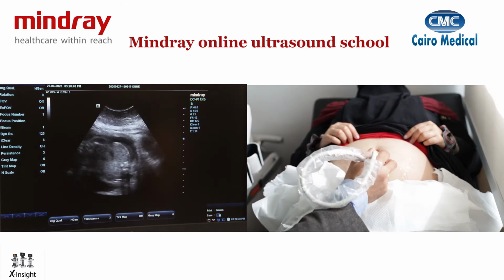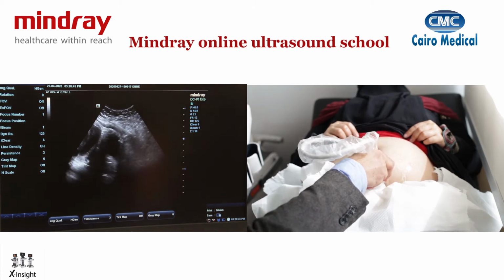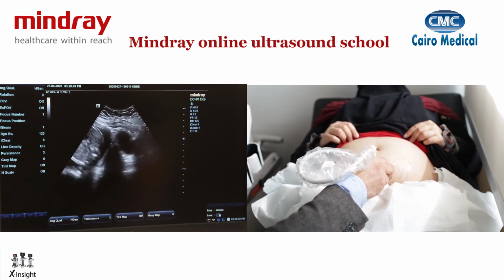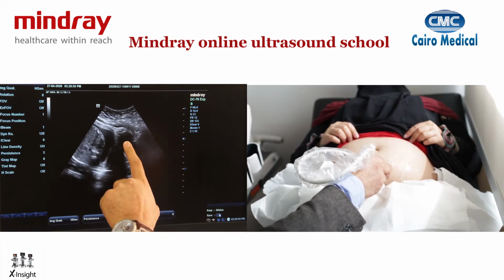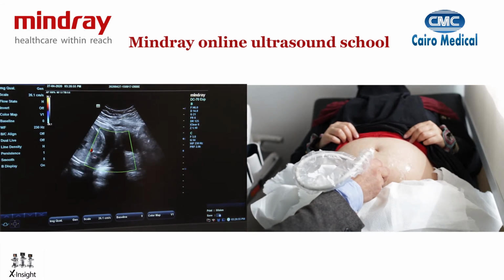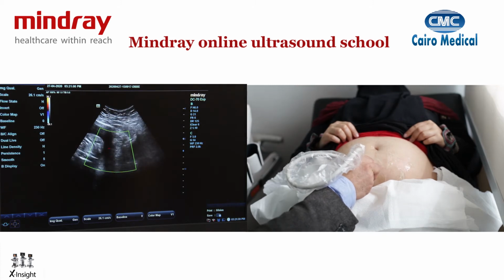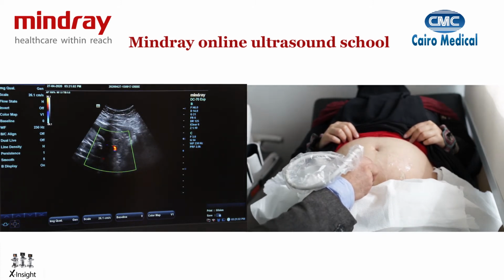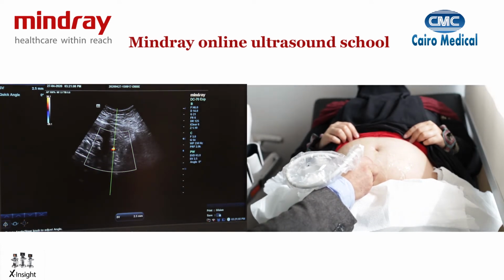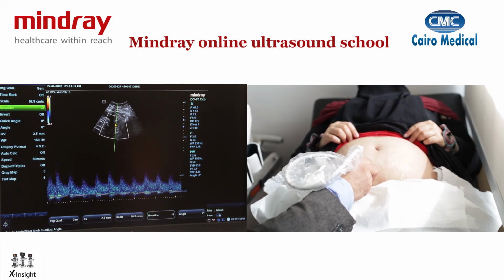So the first part of it is I'm putting the probe at a 90 degrees angle. I'm going to do a little bit of a tilt towards the patient's thighs, and what I'm seeing on the screen, as you can see here, is the mother's bladder, and I could see her cervix. And in that view, I can actually start by putting the color Doppler, and I'm going to be moving the probe, as you can see on my right hand, sideways, so I can see the uterine vessels. As you can see here, I can see the uterine vessels coming from the bottom upwards, and I'm going to be putting a pulsed Doppler and getting a wave for the uterine. So that's my first part.